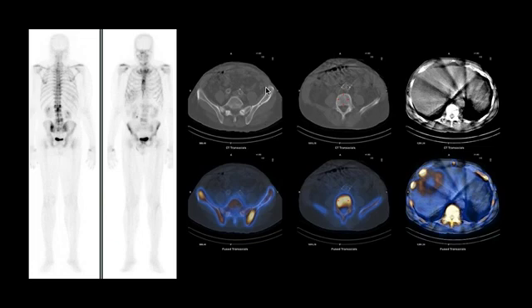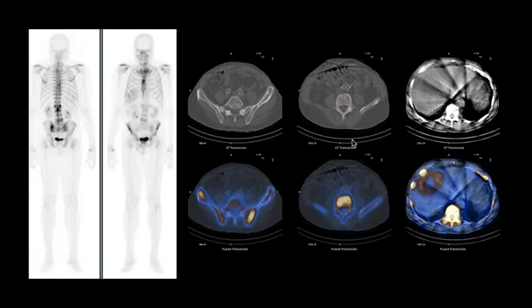On the transaxial CT image in bone windows, you can see here in the left ileum abutting the SI joint there is no abnormal sclerosis. But on the fused SPECT CT image, we see a focus of increased uptake that corresponds to this focus on the whole body image. Similarly, the uptake in the L5 vertebral body does not show any anatomic changes. This happens frequently when there is uptake on a scintigraphic study but the CT portion is negative.